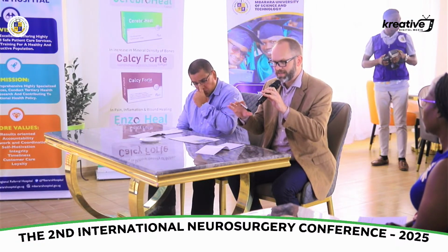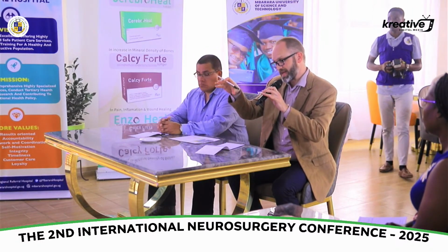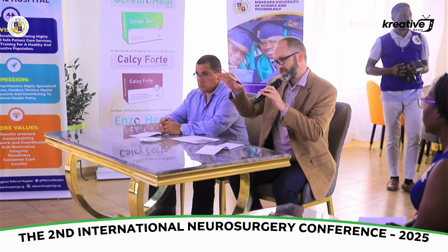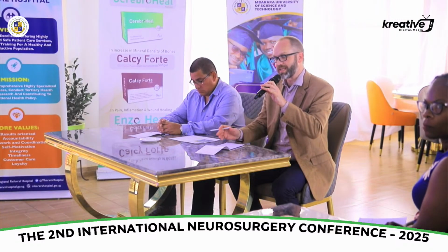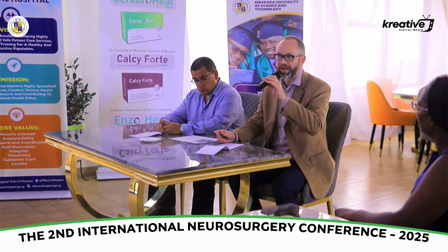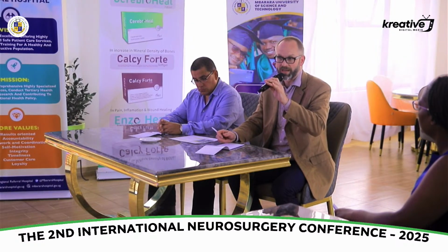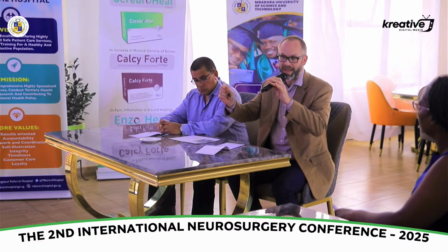And at any rate, ultrasound localization microscopy takes contrast ultrasound and then uses AI algorithms to actually track microbubbles across the screen over time, so you can actually get a tenfold decrease, down to the less than 10 micron level, you can see blood vessels. So below the resolution of ultrasound, about half the wavelength of ultrasound, you can now pick up capillary beds.